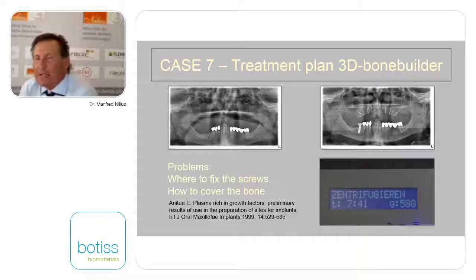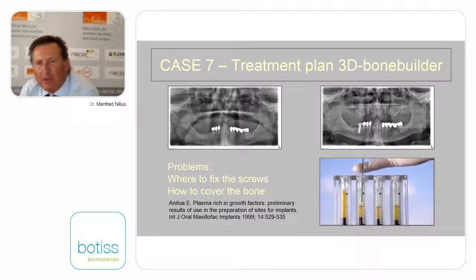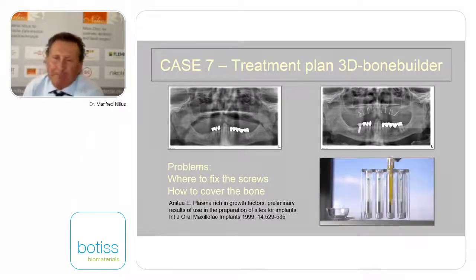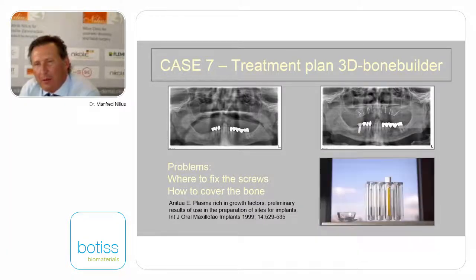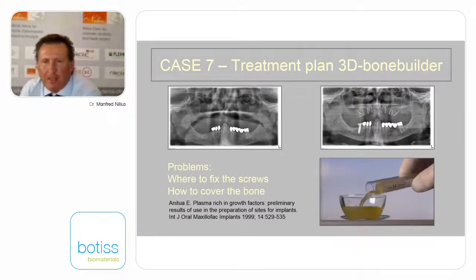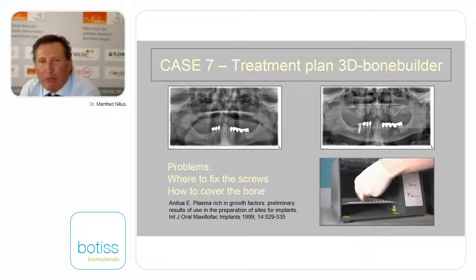And last but not least, we recommend the PRGF treatment. We take the venous blood normally, and there are 2 fractions what you can get. There is one fraction, it's called fibrin, and the second is the growth factors. When you make membranes after the method of PRGF, maybe most of you are familiar with the system, you can cover it, and the wound healing is improving.